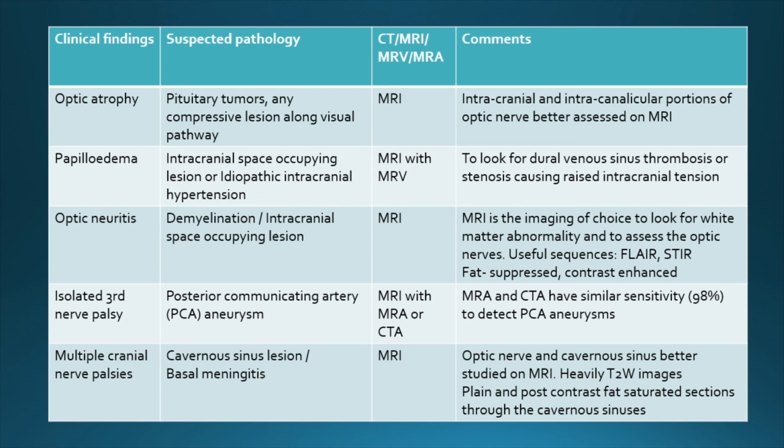In optic atrophy, MRI is the choice of investigation to rule out any compressive lesion.